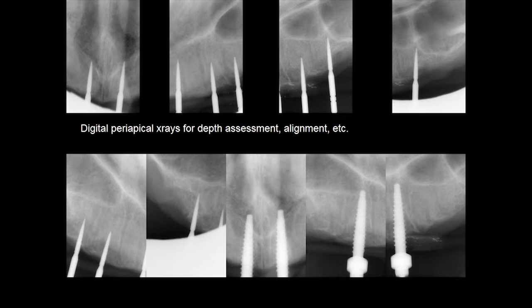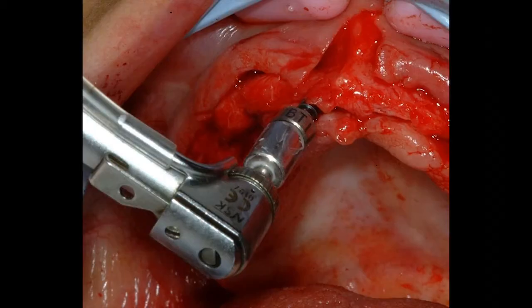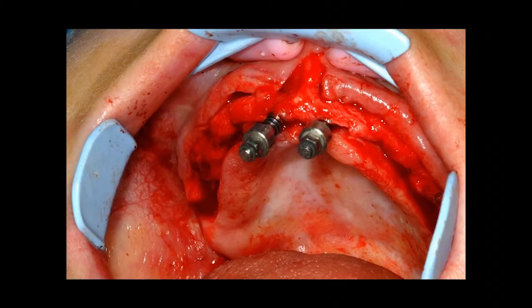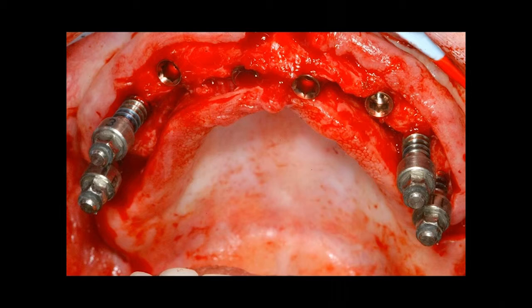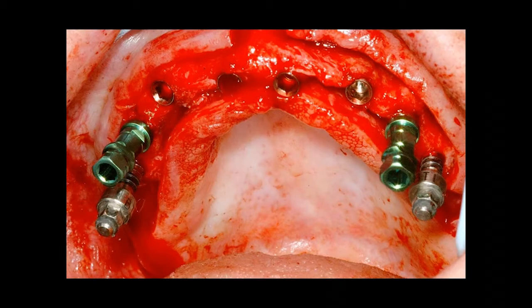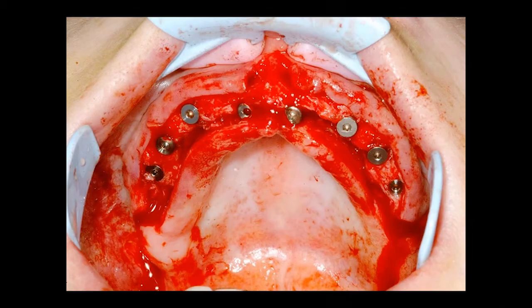Then we're going to follow up using these bone spreaders, okay? And so here's the initial BTI bone spreader going in each one of those osteotomies. Just 1, 2, 3, doing them all at once. And then we'll come back and start placing implants at the same time. These are all tapered screw heads, by the way.